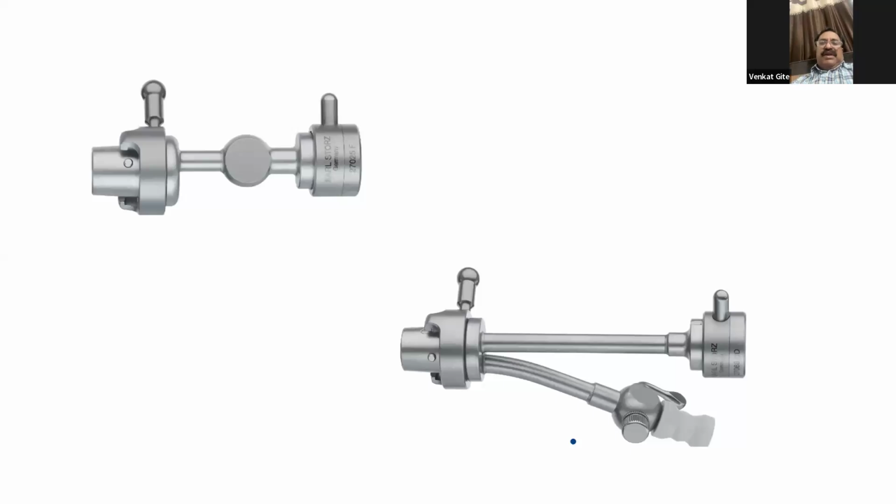So what is the benefit of a detachable bridge? The bladder can be emptied when required. Also, sir, if you want to evacuate something like a clot or stone fragments, then with a detachable bridge an evacuator can be connected, sir. Correct.